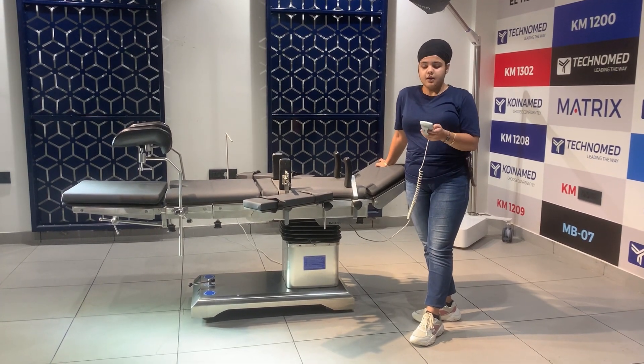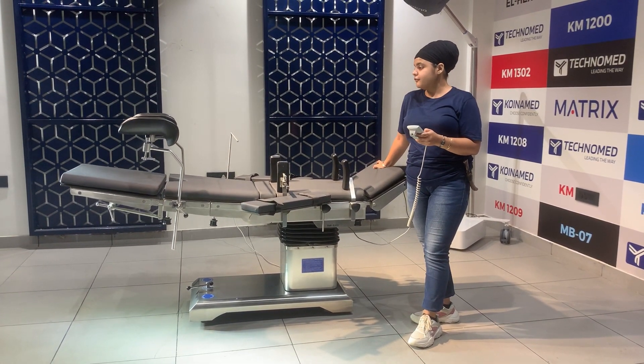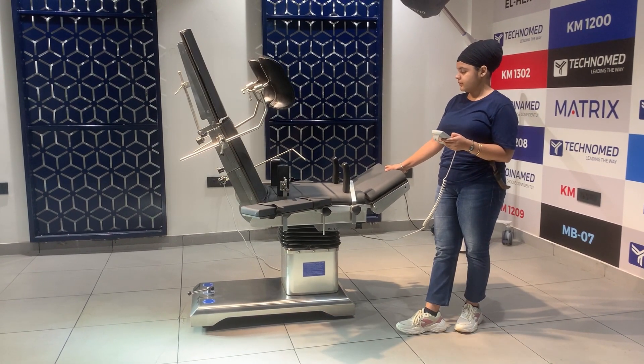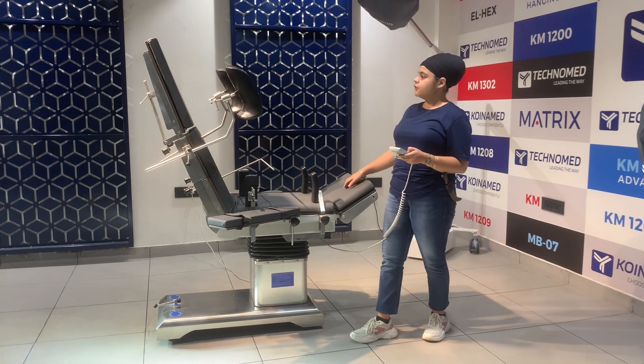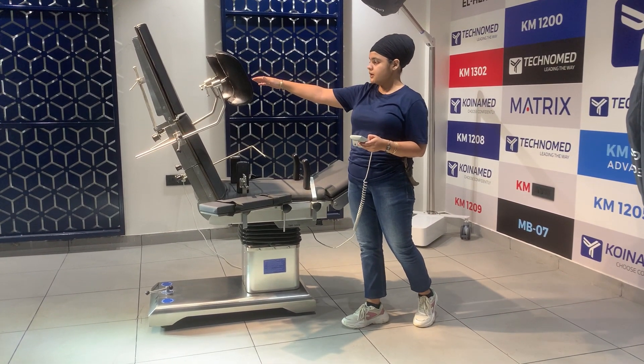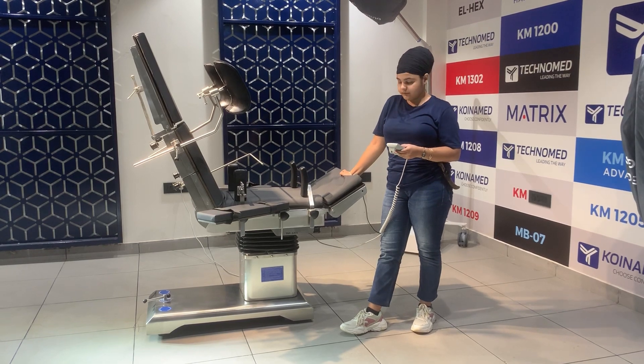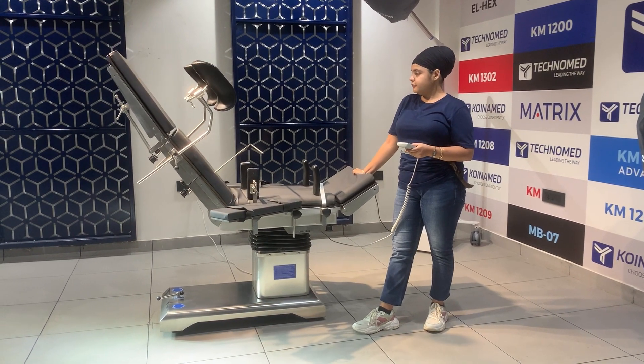Now I will show you the flex and the reflex position. If you move this part to the flex section, you can easily create the chair position on the table. Now you can see the flex position.